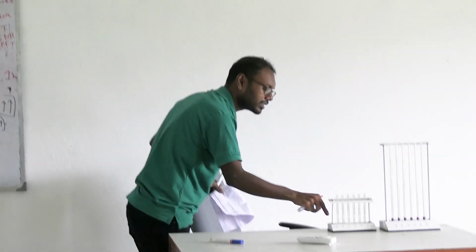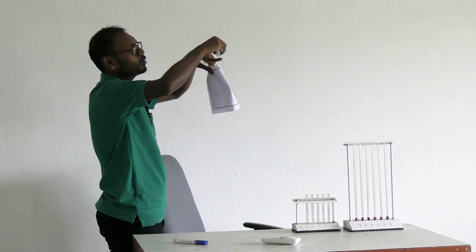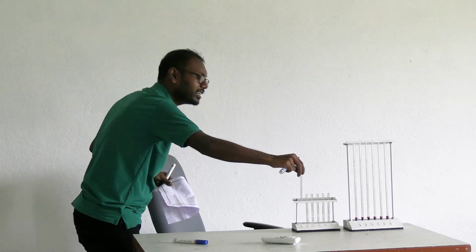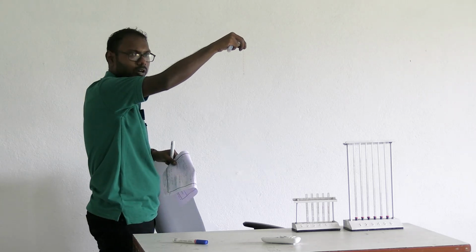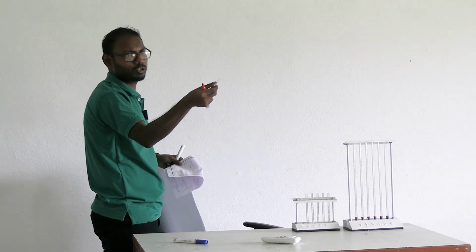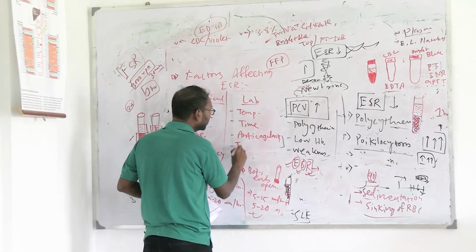When you are showing sedimentation or reading the value, the tube needs to be put straight. So the normal value, if you tilt it, the value will change. And also if you keep it bent instead of straight, then the sedimentation will not occur properly, because it happens due to gravitational pull. If you keep it bent, obviously there are vectors, you have studied that in physics, the gravitational pull will be a little less, so there will be a problem.